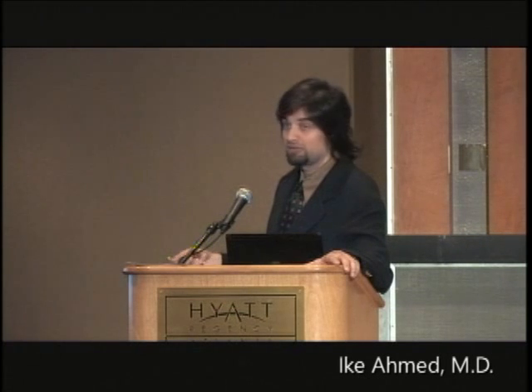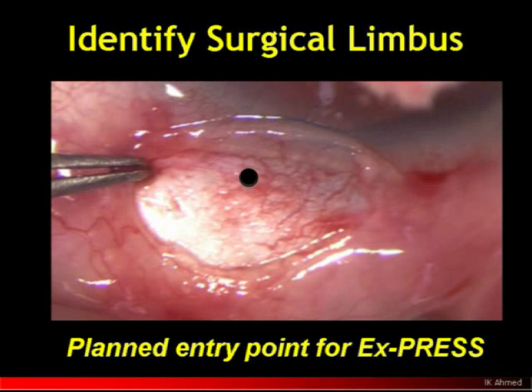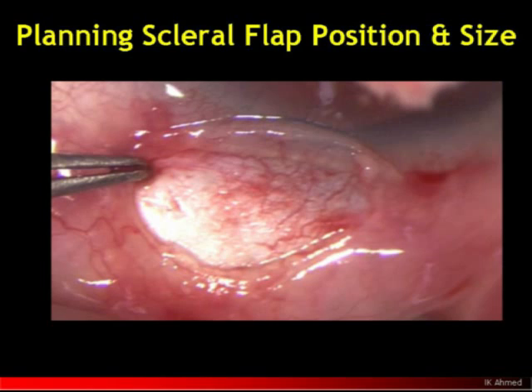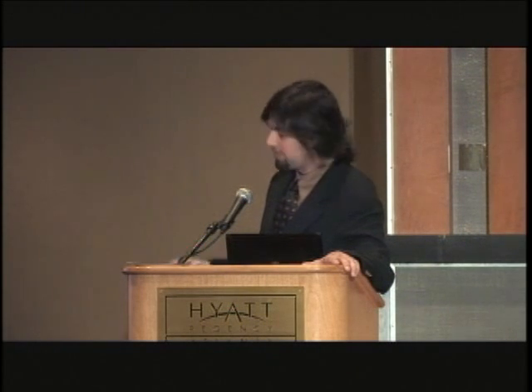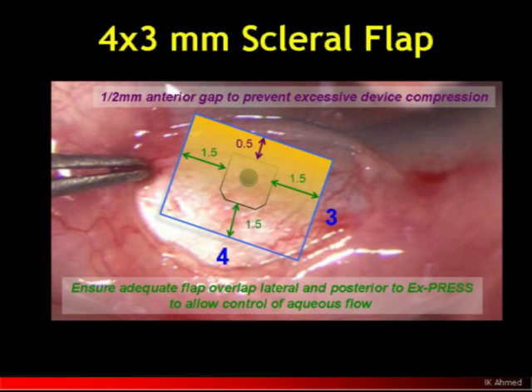We want to be at the anterior aspect of the spur for adequate placement. Even before doing the scleral dissection, that's approximately where my planned entry point will be. It's important to do this before the scleral flap is dissected because the scleral flap dimensions matter. I think it's important to ensure we have proper dimensions of the scleral flap around the implant — I prefer about a millimeter and a half around the implant to ensure adequate resistance with scleral sutures.